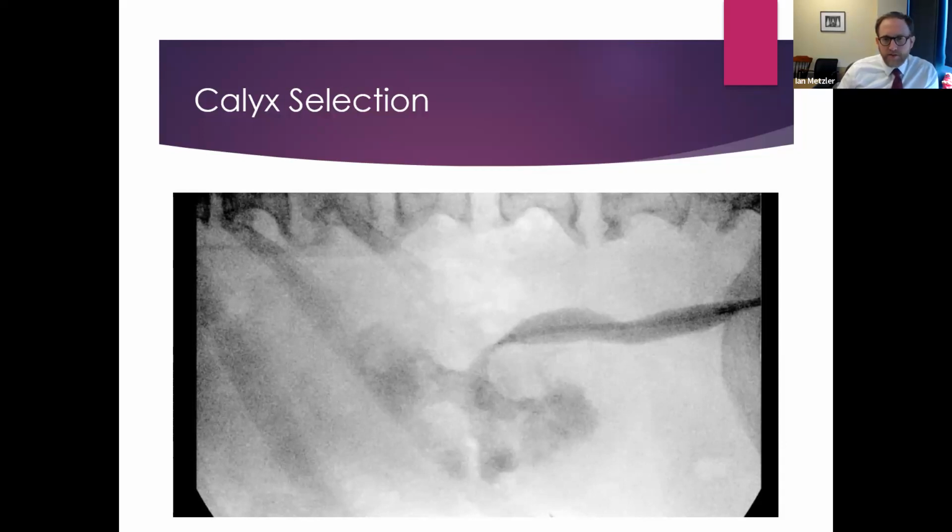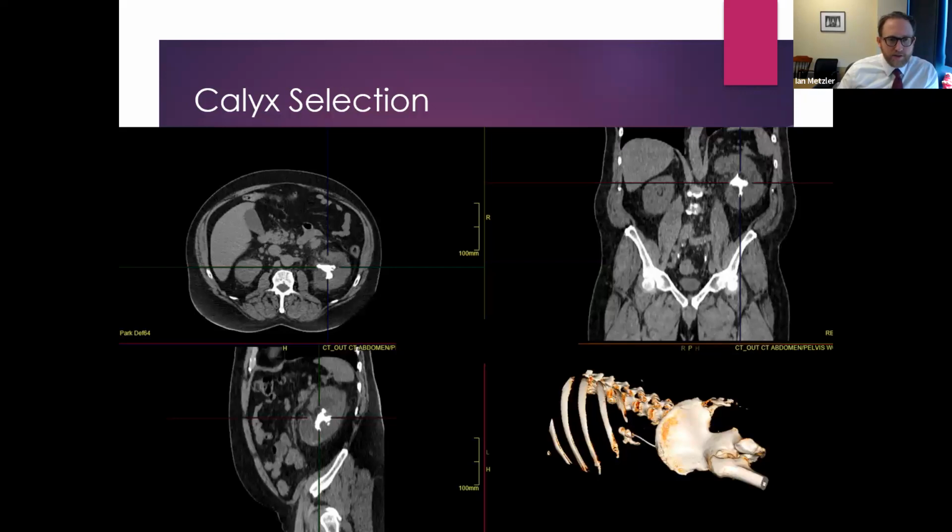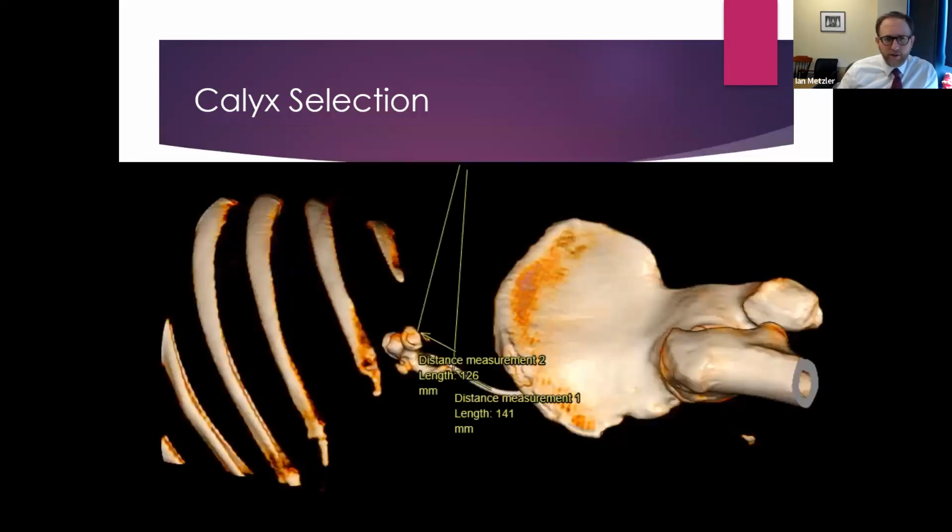There's tons of stones in this patient, as you can see from the CT scan here. And I've just done a little three-dimensional reconstruction of the stones that helps me think about in my preoperative planning where I'm going to go. So these are kind of in the way here, but my point of this slide is for calyx selection, we would very often go towards the lower pole axis. But you can see here that by selecting the lower pole axis, you have a really acute angle in order to get your nephroscope up to the rest of the stone.